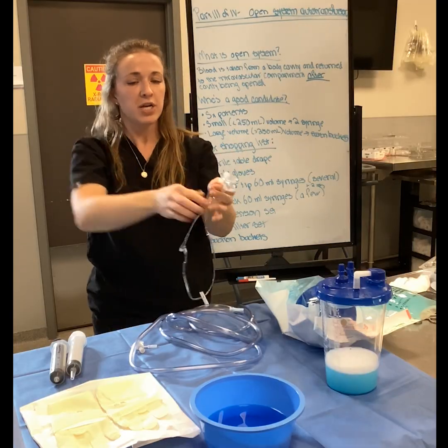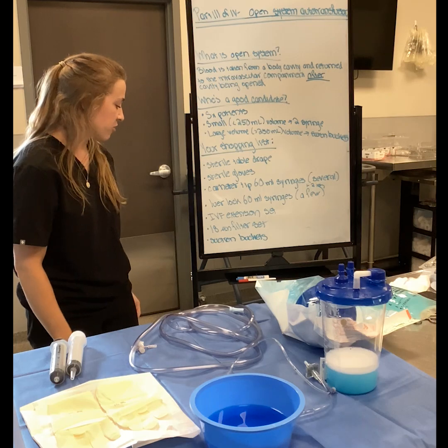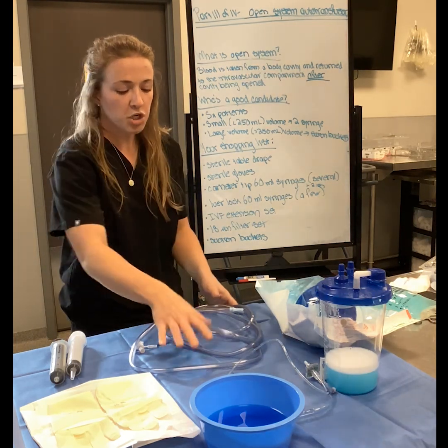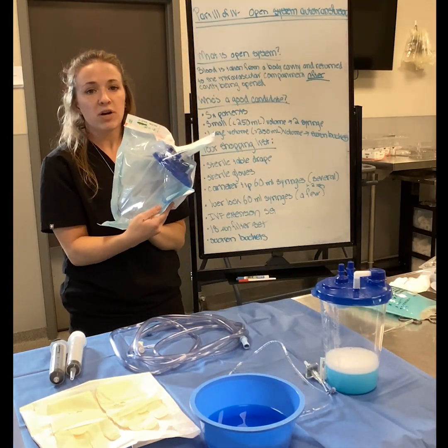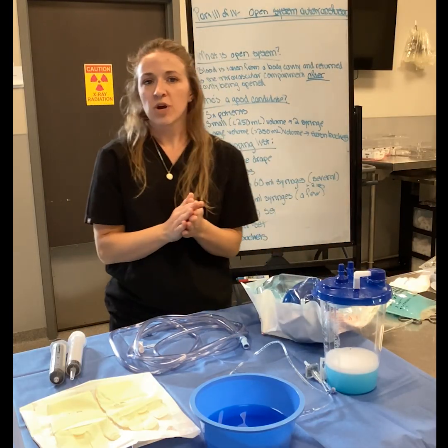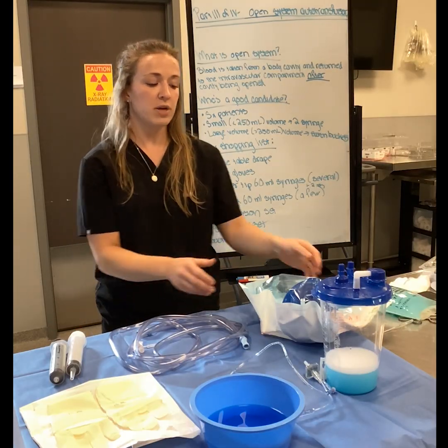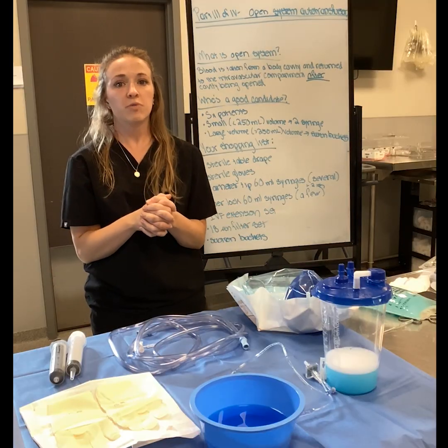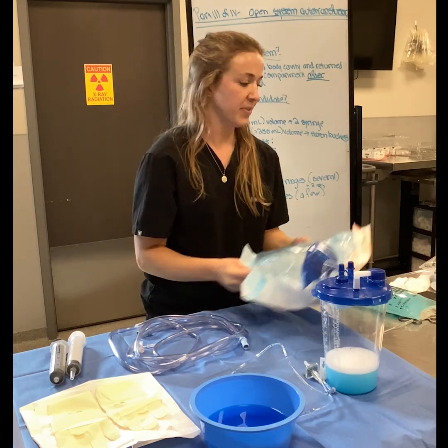This attaches to the patient and you just bolus that blood right back into the patient. Now, what else would we need here? If you are doing a large volume effusion, you should also have sterile suction tubing and ethylene oxide gassed or sterilized suction buckets. Because we're trying to maintain asepsis the best possible way we can, I would strongly recommend the use of gas buckets instead of just a bucket that's sitting on the shelf. You want to try to eliminate the possibility of bacterial contamination in any way that you are able.